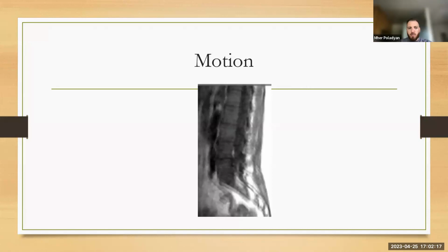Blurry. It's blurry, yeah. Distorted. We can't tell where the disc spaces are very well. Everything's kind of blurry, cloudy. So this patient's moving in there. They're dancing in there. And so we are limited in MRI in how we acquire this data. If we acquire slowly, which we do in MRI with most of our sequences, we start to incorporate some of this motion in our image.